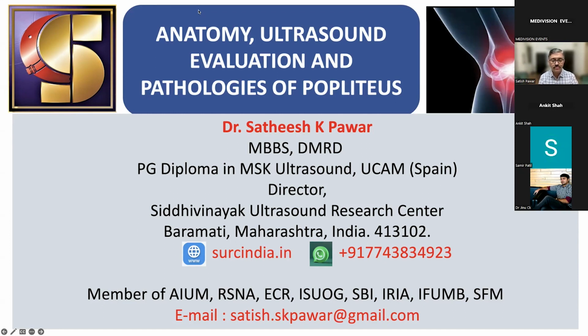So, tonight we have Dr. Satish Pawar, who will be talking on an absolutely new topic, something which a lot of us don't really evaluate on ultrasound. He's going to be talking on the popliteus tendon, how to scan the anatomy and the common pathologies encountered. This is something really new, so I think there's something in it for all of us.